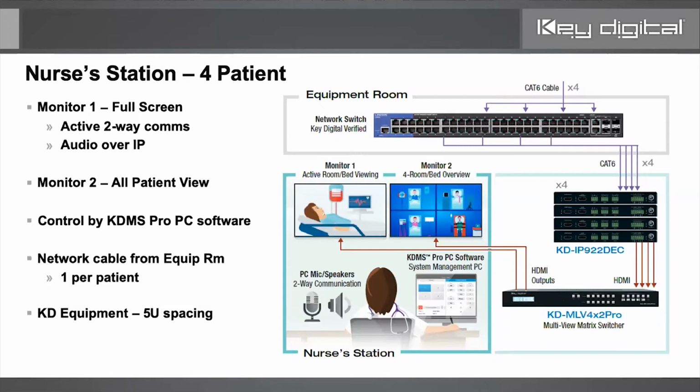If you take a look at the bottom right-hand corner near the nurse, that's the control system. It looks like a computer at her station. From that computer, she's able to do the controls we were talking about: zoom in on a patient, tune in to the audio on the patient, move the camera around, etc. So all those functions are right there.